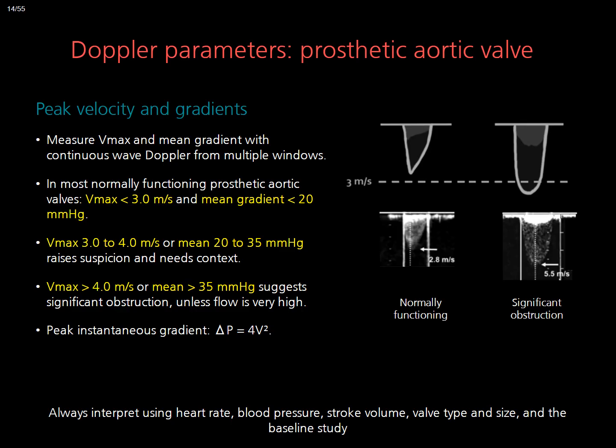Remember that the simplified Bernoulli equation gives the peak instantaneous gradient as 4 times velocity squared. Finally, always compare with the patient's baseline post-operative study, because change over time is often the most important clue.